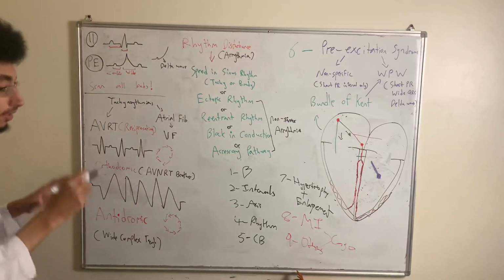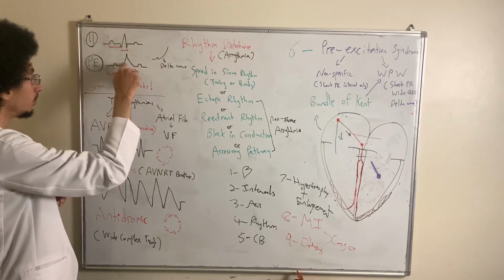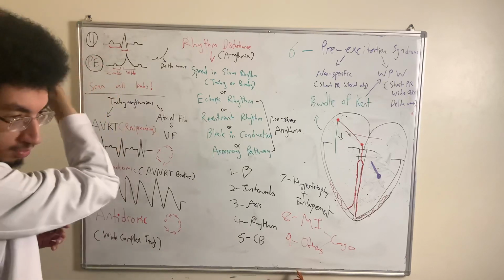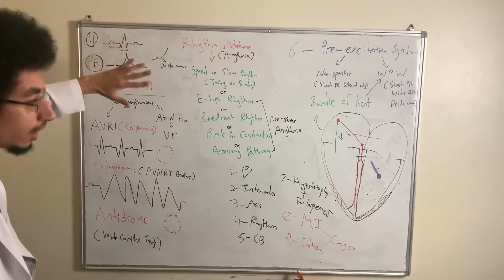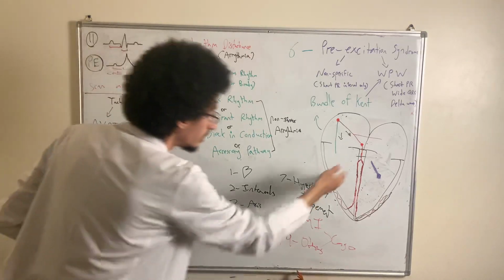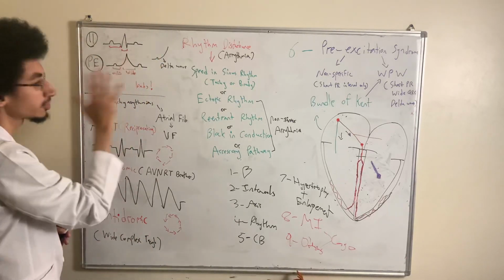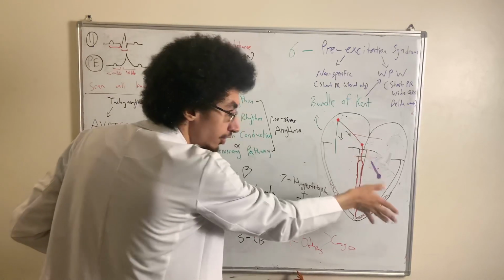And thus, we will have what we call here a QRS. Alright, we'll have a QRS, Mumtaz. So that's what we'll have here. We'll have a normal QRS initially. So we'll have this as usual, Mumtaz, due to left ventricular depolarization. Okay? So we'll have an R wave as normal, and we have an S wave. However, this is the normal pathway.